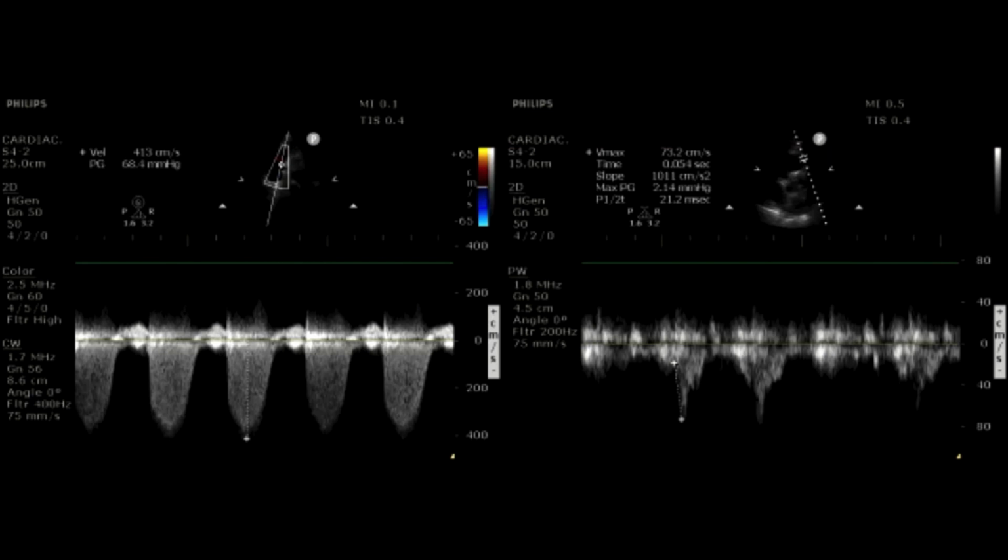You're the clinician at the bedside, whether you're in the ED or the critical care environment. You have a patient that's either a known or an unknown PE. How do we then interpret this data that we're gleaning in front of us? And what can we say? Let's presume, for the sake of the example, that we're seeing an undifferentiated patient. We don't know if it's a PE. We're assessing the patient. We start seeing this. How should we start using this in our thought process, in our workflow for PE?